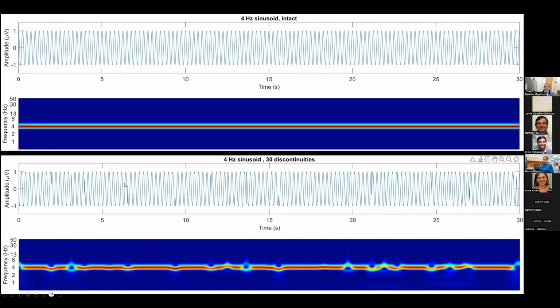And how does that affect the time frequency representation? It looks like this. You can see sometimes the central power goes down below 4 Hertz. That's because this McDonald's-like shape is more like one big oscillation with a lower frequency. Or sometimes the power goes up because the discontinuity created sharper spikes. And whether the central power goes up or down, every time a discontinuity happens, you see this conical shape where power goes up to the higher frequencies. That is because this very, very fine spike contains a lot of harmonics, and harmonics are the collection of higher frequencies. So you see the conical shape everywhere.